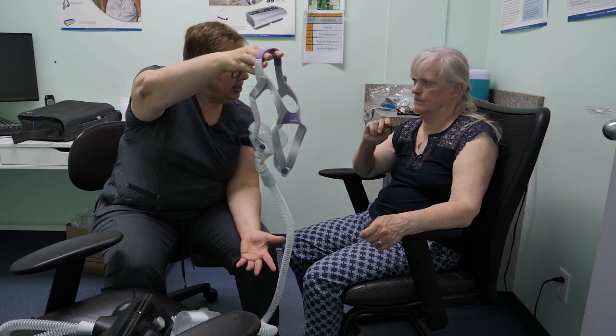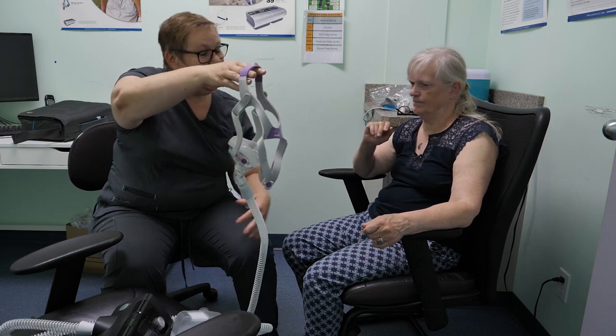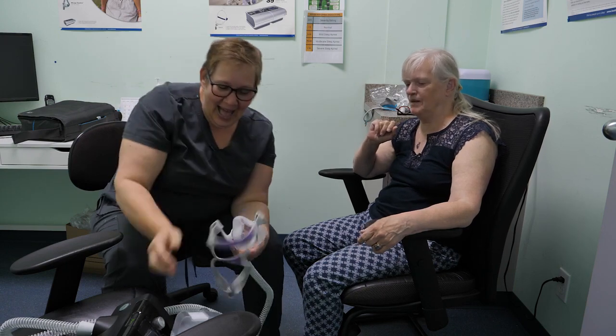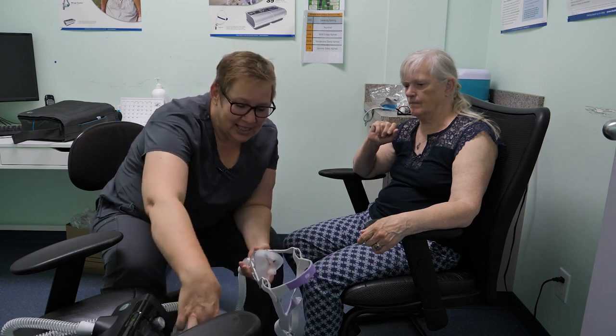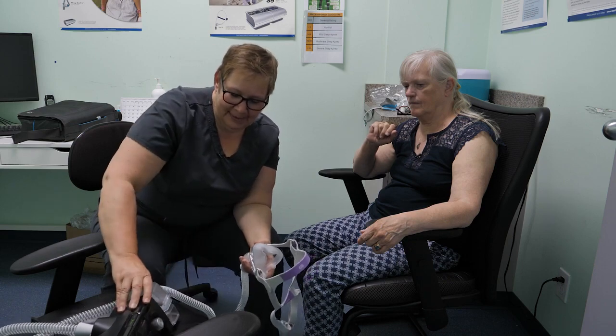So if you wash it in the morning, then it will be dry by the time you're ready to go to bed. And you don't have to remember all of these instructions because I have them written down for you. Okay. The humidifier chamber, once it's rinsed, can just air dry. It doesn't have to hang or anything. You can just let it sit, and then you can put it back in your device when you're done.